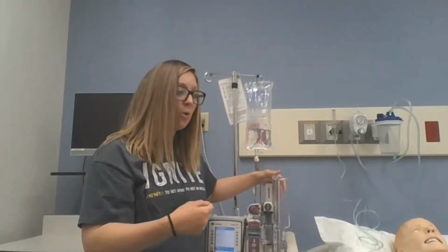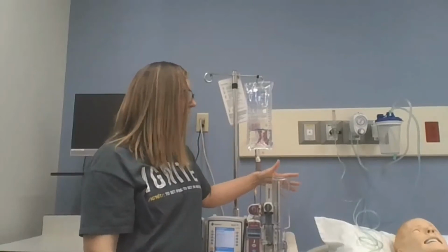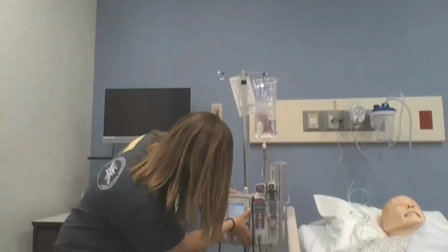of it, because one of two things would have happened. Either they're too sedated and you need to address that, or you can assess their need for additional pain medicine at that point. So I always tell families, you can actually cause them to stop breathing and have them go into respiratory arrest if you hit the button while they're sleeping. And so wake them up, and if they're not able to wake up, then come get me. That's the best thing to do so that they don't hit the button.